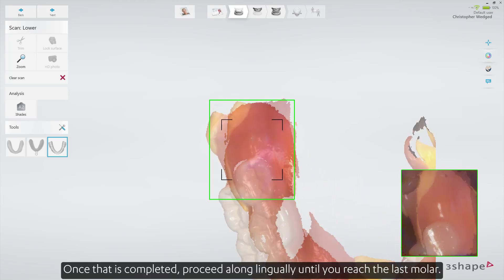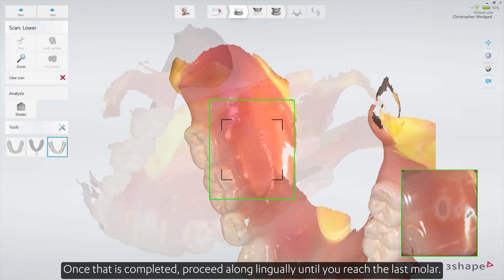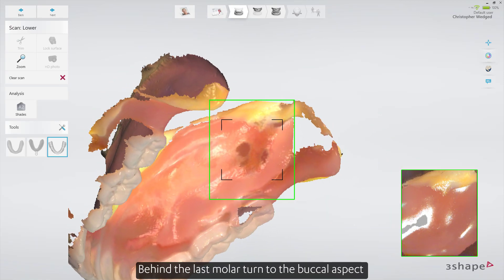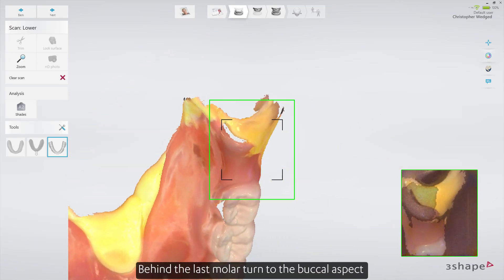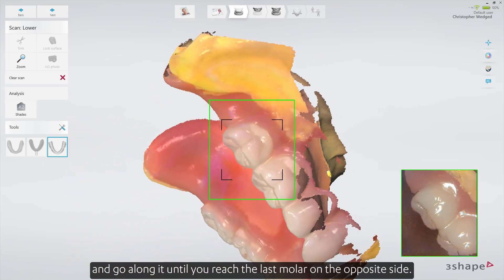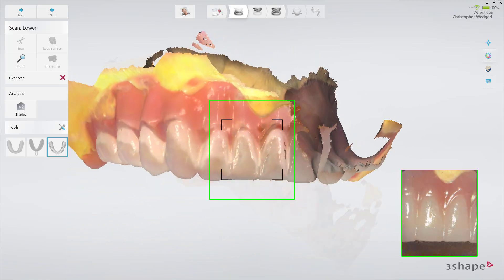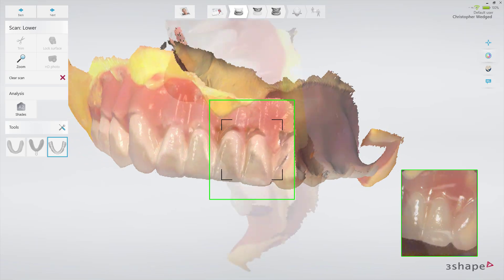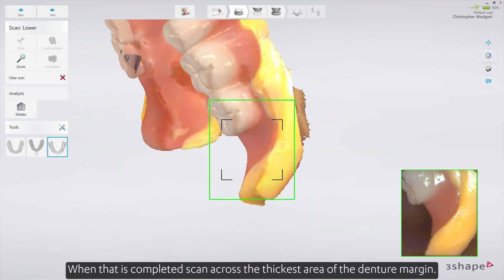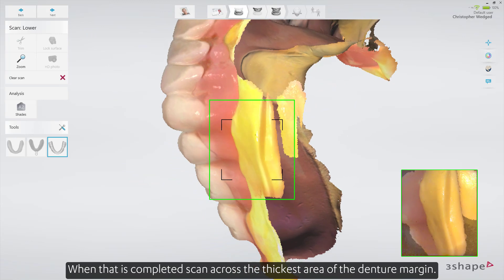Once that is completed, proceed along lingually until you reach the last molar. Behind the last molar, turn to the buccal aspect and go along it until you reach the last molar on the opposite side. When that is completed, scan across the thickest area of the denture margin.